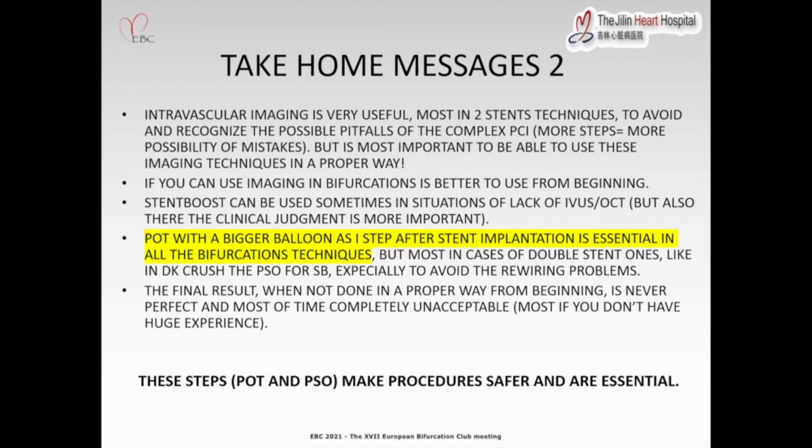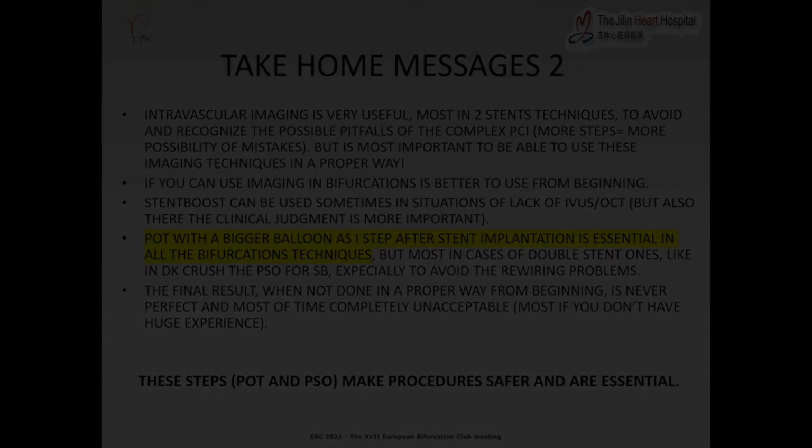The final result, when not done in a proper way from the beginning, is never perfect, and most of the time completely unacceptable, most of all if you don't have huge experience. These steps, POT and PSO, make procedures safer and are essential. Thank you very much for your attention.